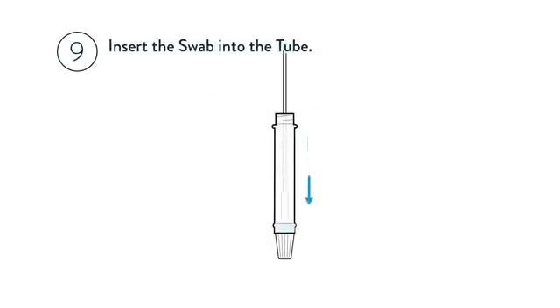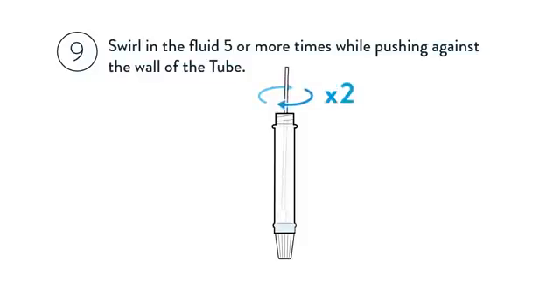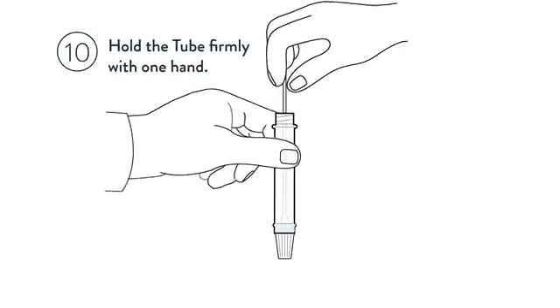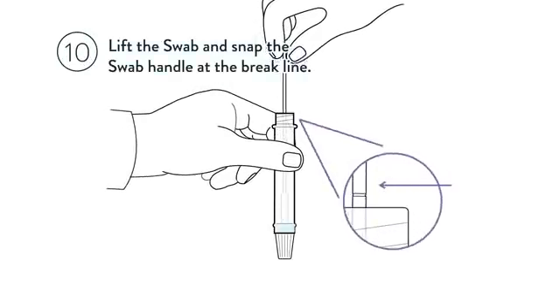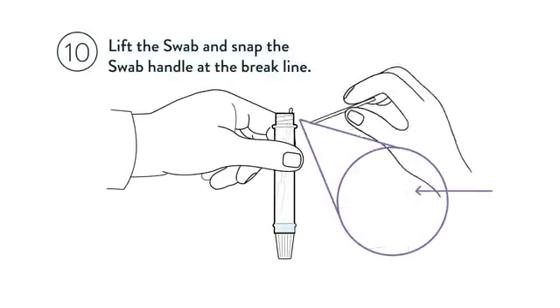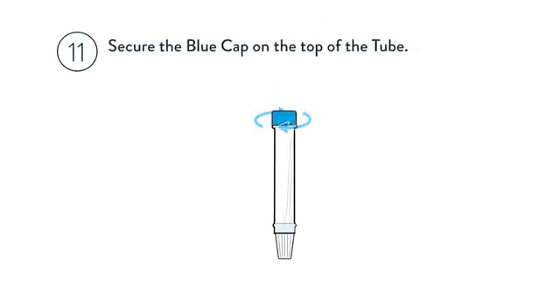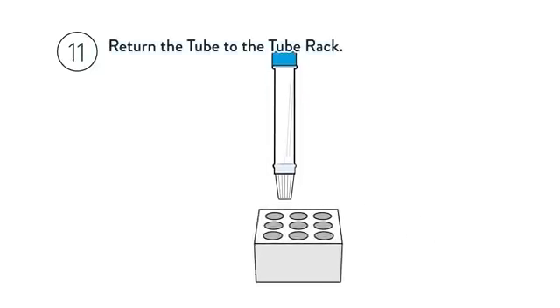Insert the swab into the tube. Swirl in the fluid 5 or more times while pushing against the wall of the tube. Pinch the swab tip through the tube to remove any remaining fluid. Hold the tube firmly with one hand, lift the swab, and snap the swab handle at the brake line. Leave the swab in the tube and discard the stick. Secure the blue cap on the top of the tube and return the tube to the tube rack.